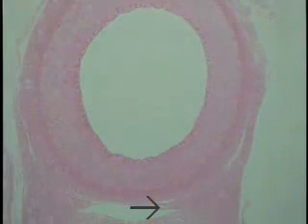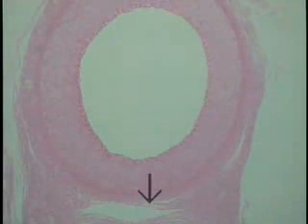As is true with the naming, if you think about it, for the elastic arteries, so designated because of the abundance of elastic laminae within the tunica media area. Now usually, though we can't resolve it right here, though it's apparent down at the bottom of the field, there's a boundary, another elastic membrane that achieves prominence, the external elastic lamina. That's pretty well developed in these muscular or distributing arteries as well, and it lies at the boundary between the tunica media, which is here, and the tunica adventitia, this connective tissue layer shown here.